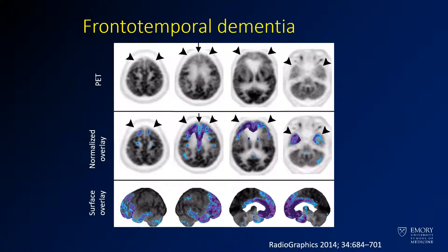Here you see frontotemporal dementia. Again, you have raw images across the top and a normalized overlay. You'll see decreased activity in the frontal lobes and also decreased activity in the temporal lobes. That one's easy to remember because the areas of abnormal activity are in the name — frontotemporal dementia.